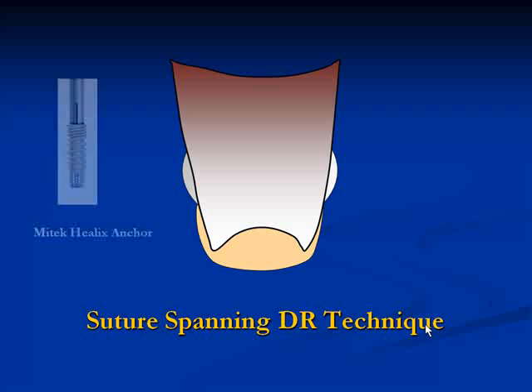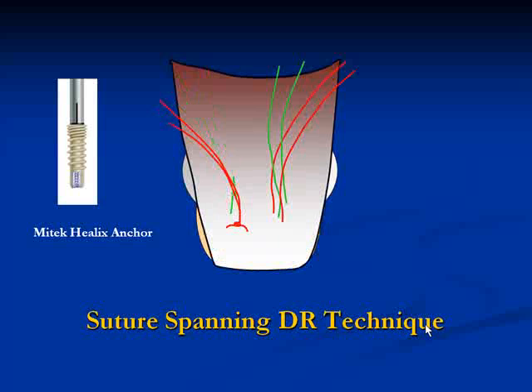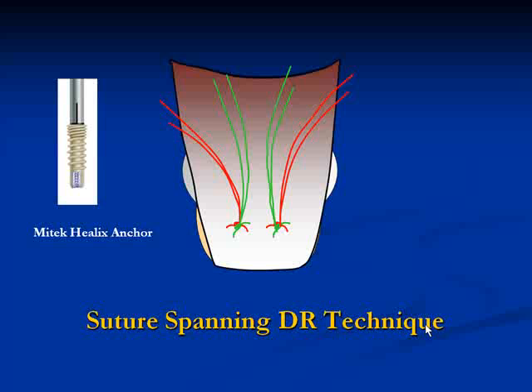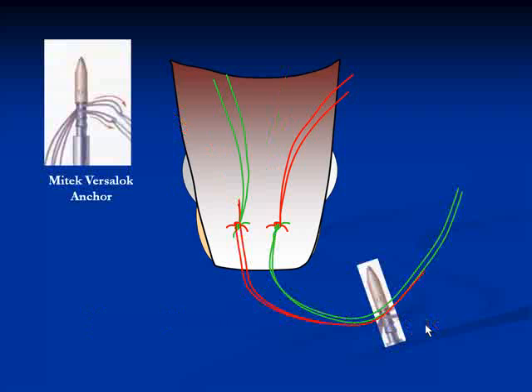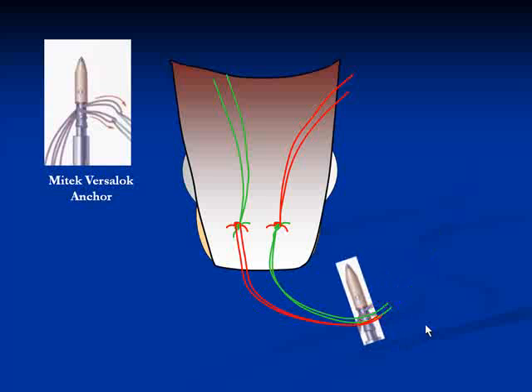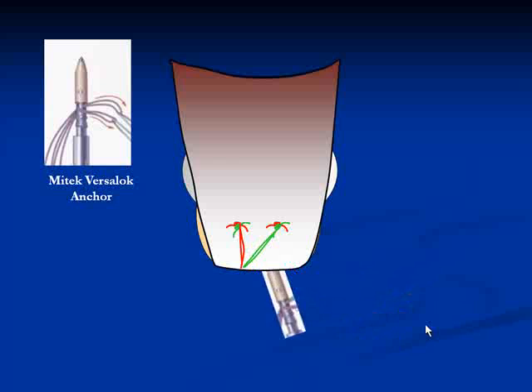So the technique I usually use involves using the helix anchors in the medial row. I usually have double suture loaded anchors, do a double mattress stitch, and then use the suture limbs to span laterally through the VersaLock anchor, which is implanted in the lateral row position, and the sutures are tensioned and then locked down into place in a sort of crisscross configuration, which compresses the tendon against the footprint.